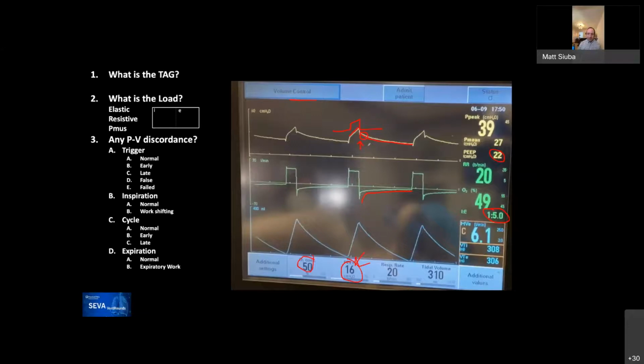And actually, I changed it out. I checked it myself. I even hooked up a BVM right to the expiratory filter, and there was no resistance to flow there. So the presumption was that there was a valve issue or a cassette issue within the ventilator itself. So we switched the entire ventilator, and this problem went away. So it's purely a mechanical issue rather than a patient issue.